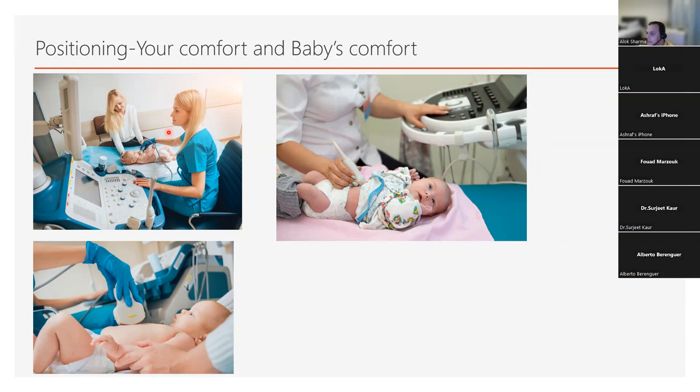So what are the problems here? One of the problems is obviously this baby is quite active. You can hold the arms. Is he going to like that? No. So what I'd say, something else to play with. Yep. So you can give him something else to play with, or you can give him some sucrose with a pacifier, which will keep him interested, which will divert his attention. But really what I'd say is anterolateral scanning will not be a problem. You've got good exposure over here. This baby's anterior lateral regions are well exposed.